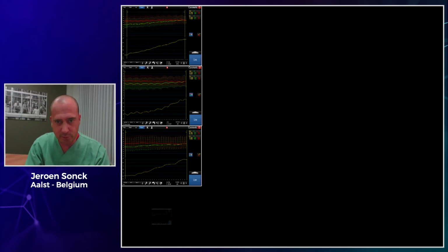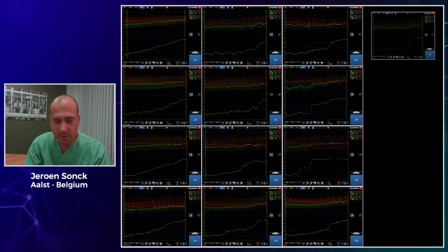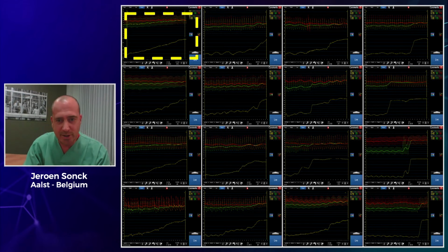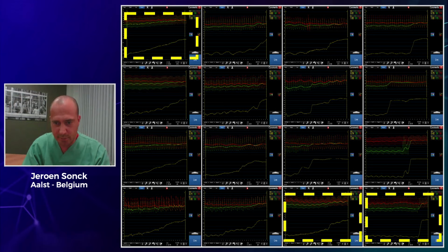The next step, of course, looking at all these curves, some of them are very easy to interpret. And I think that everybody agrees, Divaka, Bernard, everybody, when you look at this curve on the left upper part of the panel, that this is a diffuse pattern. On the other hand, the right below panel, there you have a very focal disease, so a high PPG. There is no discussion. The discussion starts when we start having traces like this or pullback curves like this. There's a diffuse with a small step. Is this focal? Is this diffuse? Is this the good target?